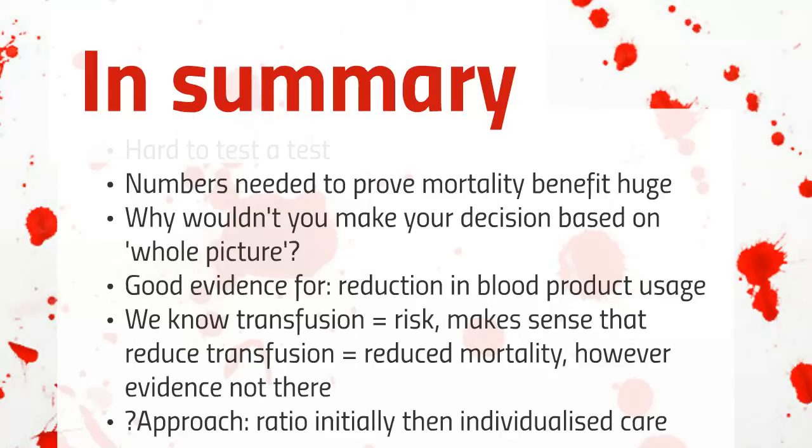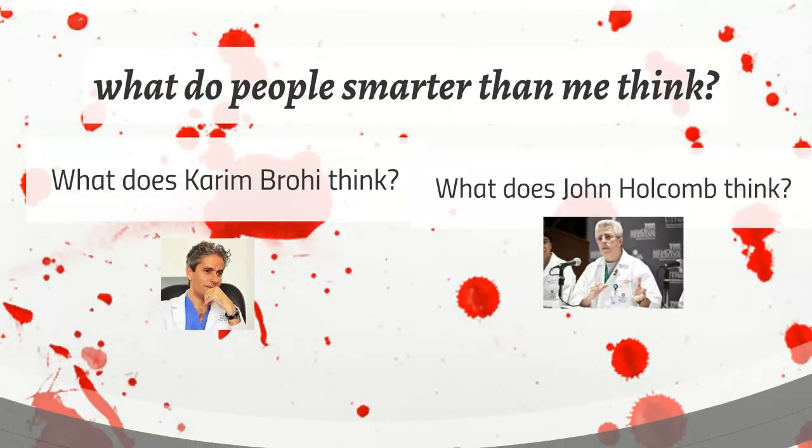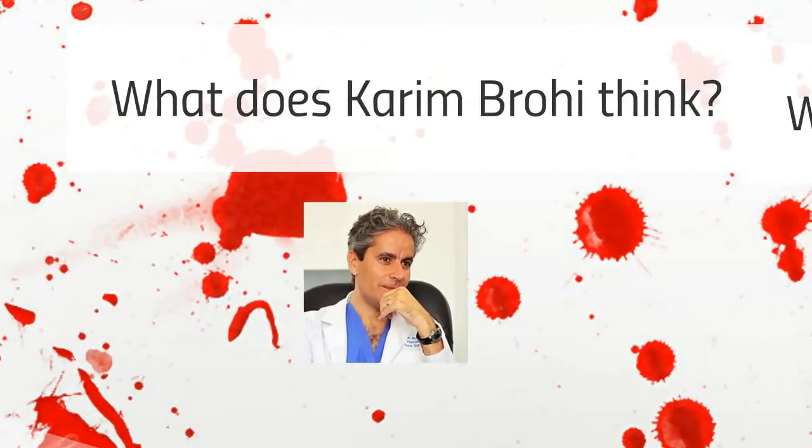And what are we left with? Well, an approach that's prudent might be to use a ratio-based approach initially in the very first stages, until you can get point-of-care testing, and then you can individualize your care to that patient and that patient's specific needs. Now, that's a brief overview, but what do people much smarter than I think about ROTEM? Let's hear from Karim Brohi.